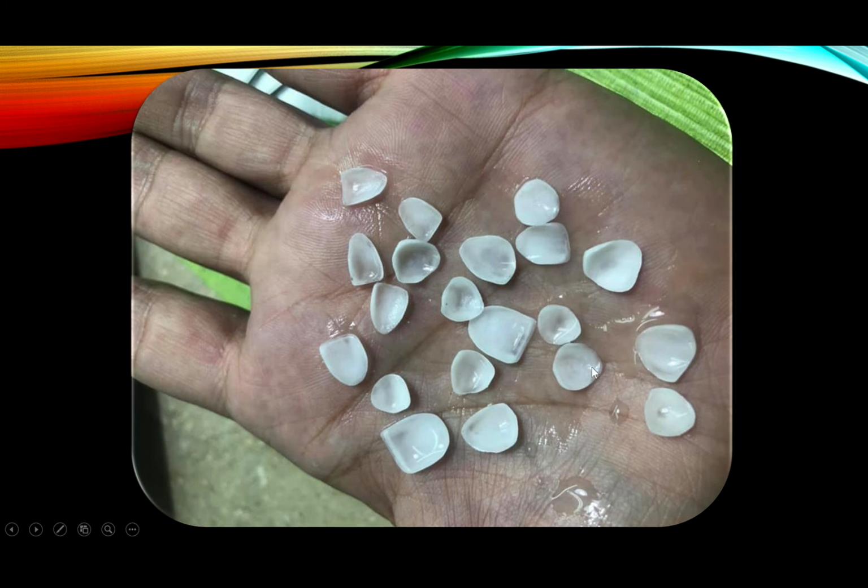That's me holding that same case in my hand. With wet water, look, you can see through. It gets thin. Over here, for example, this central has a bulk of dentine, or say it has thickness. But look over here where I did my micro layering, nothing, almost nothing. This layering, by the way, or light reflection, is not a crack.